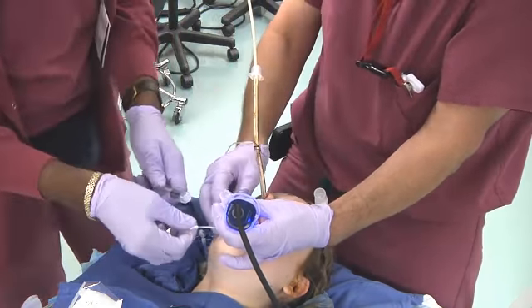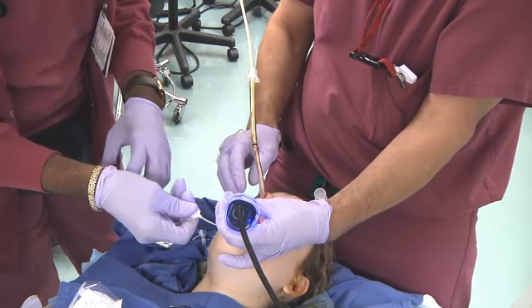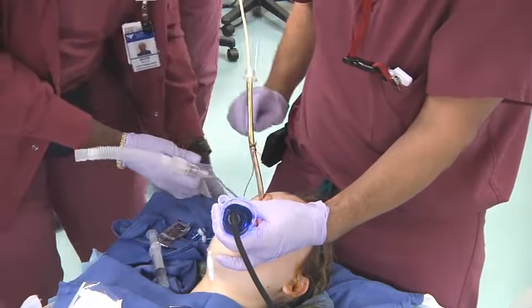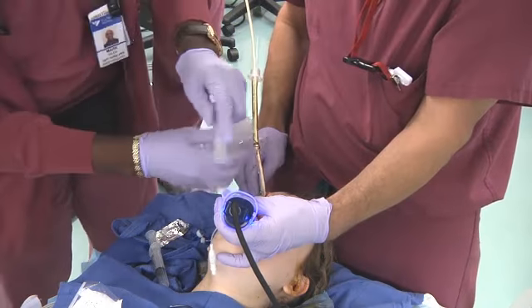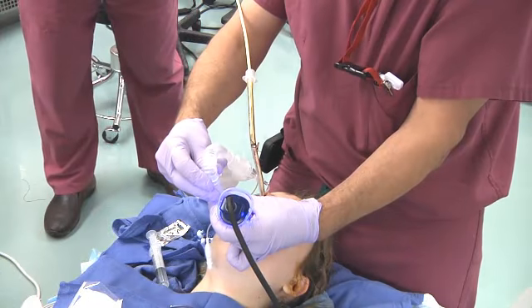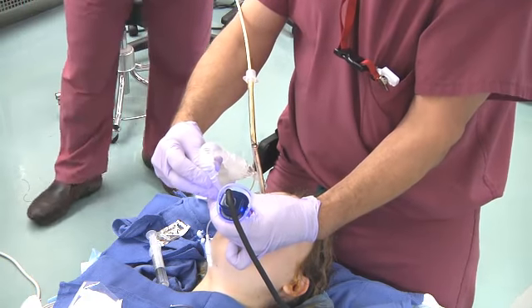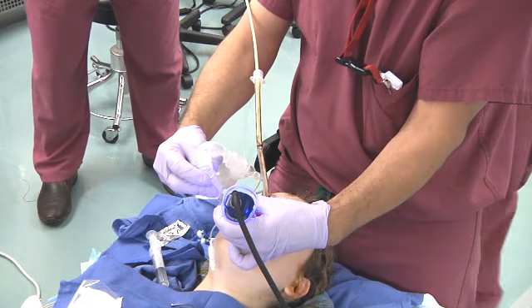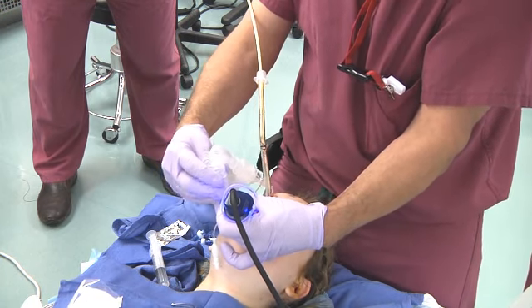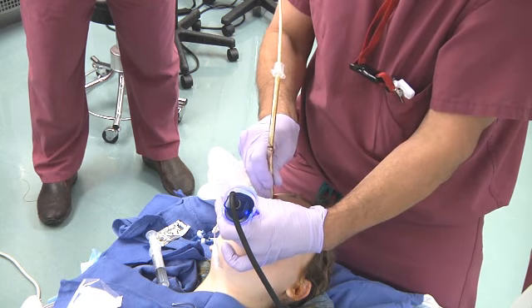The cuff of the oral tracheal tube is inflated. The anesthesia circuit is attached and ventilation confirmed. Once the team is satisfied that the oral tracheal tube is in correct position, the airway exchange catheter is removed.